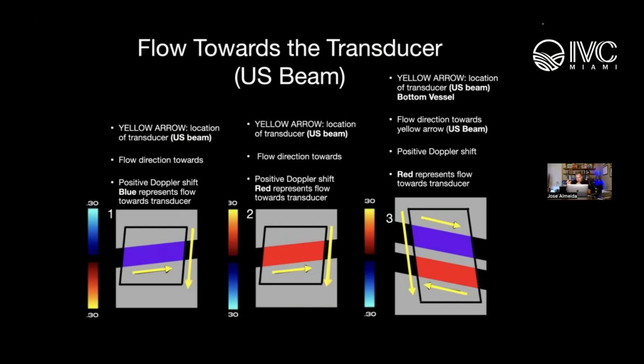That's different. On the ultrasound screen, there's usually a company logo on either the right or the left. And on the actual transducer, there's a notch that you can feel that orients the probe direction to the company logo. That'll tell you the cranial caudal direction.